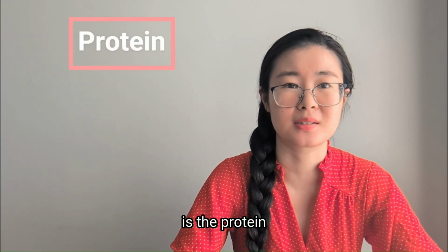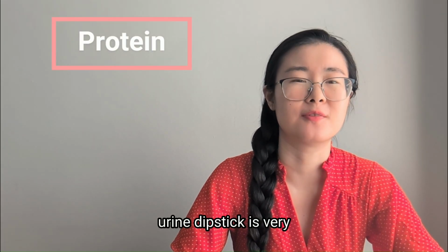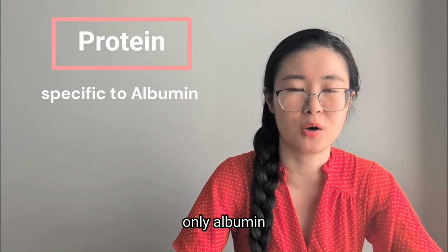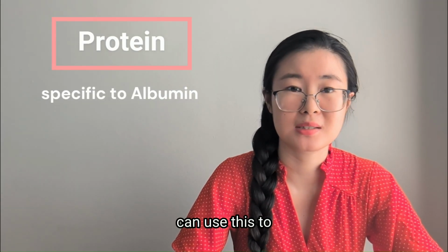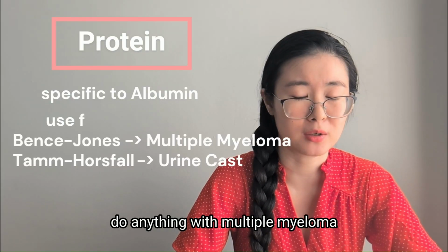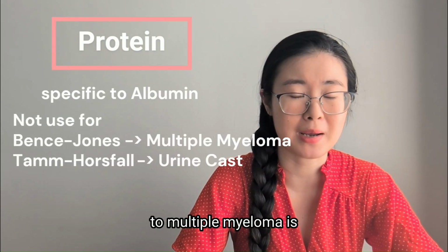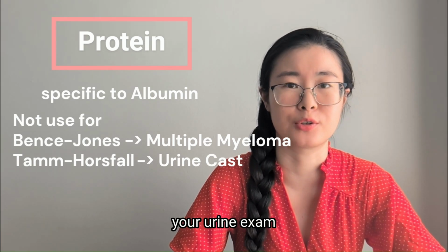Next test is the protein. The protein test on urine dipstick is very, very specific to albumin, only albumin. So if the test is asking you if doctors can use this to do anything with multiple myeloma, your answer is no. The protein that is linked to multiple myeloma is called Bence-Jones. It is not going to show up on your urine dipstick.